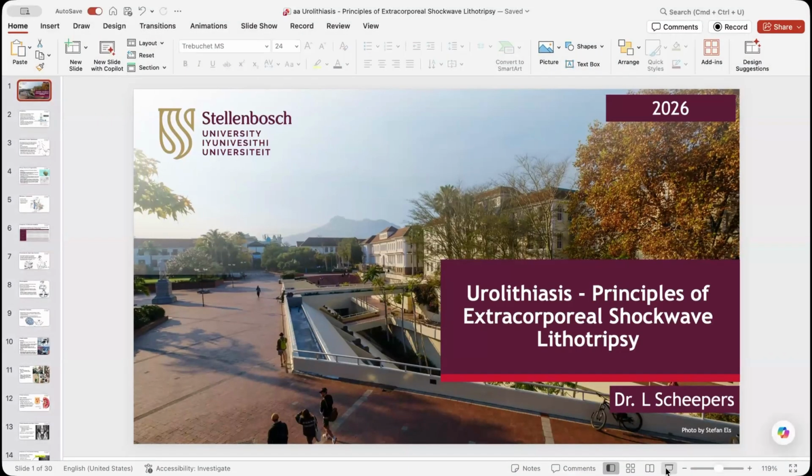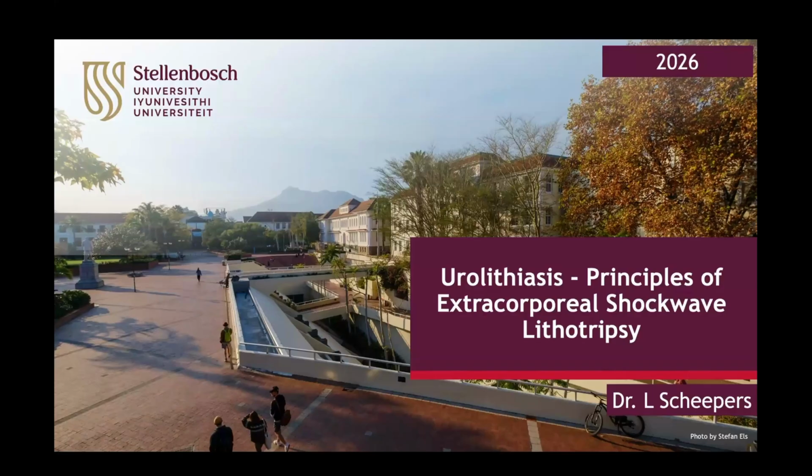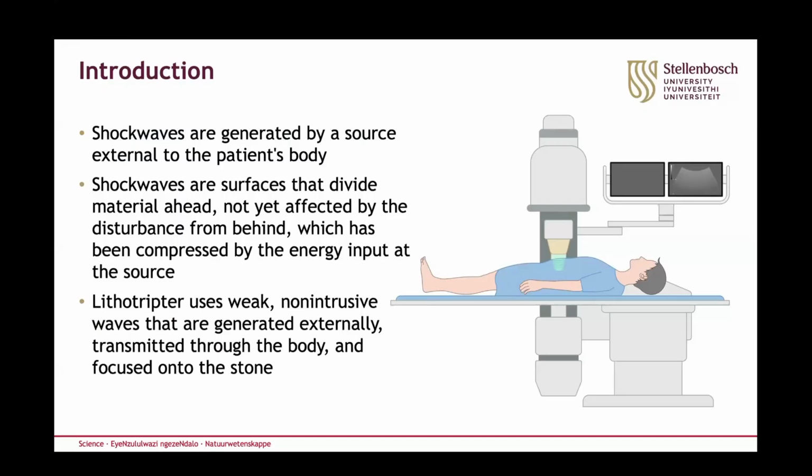Right. Good morning. So I'm Leo Scheepers. I'm one of the registrars at Tygerberg, and as mentioned, we will be going through the principles of extracorporeal shockwave lithotripsy. Looking at the introduction, shockwaves are generated by a source generated externally to the patient's body. Shockwaves are surfaces that divide material ahead, not yet affected by the disturbance from behind, which has been compressed by the energy being input from the source behind it.